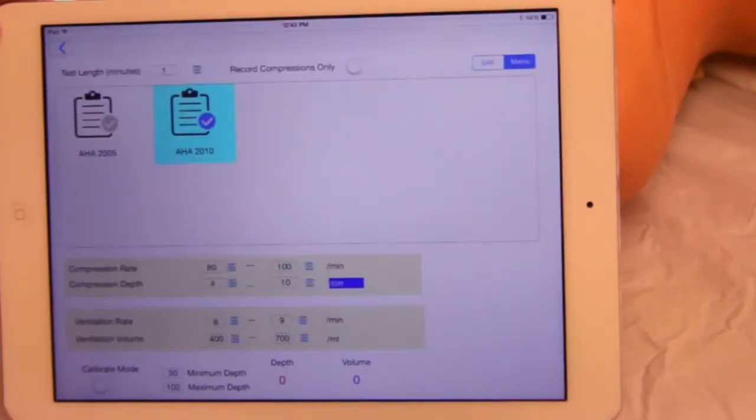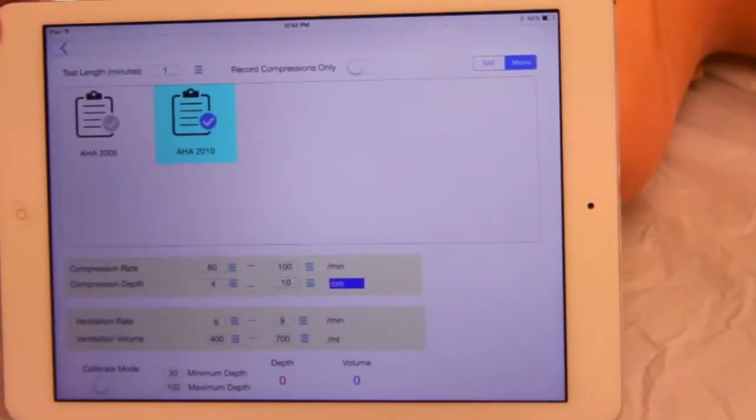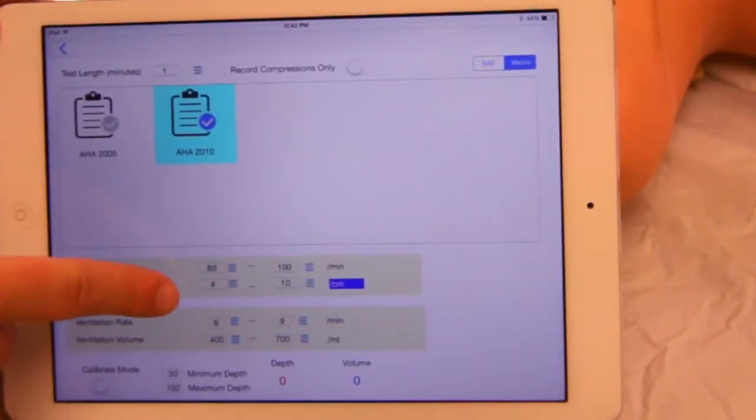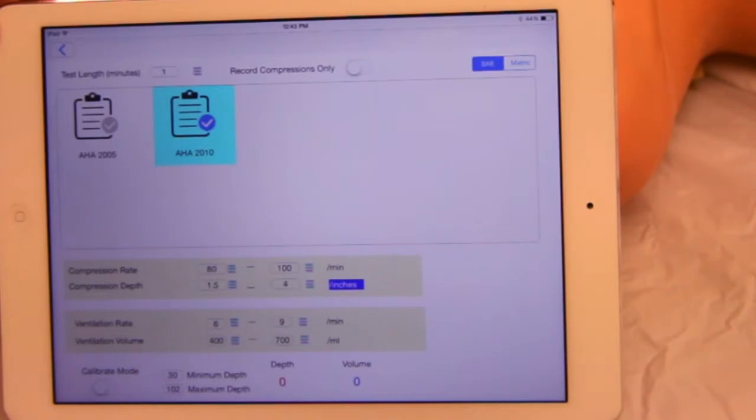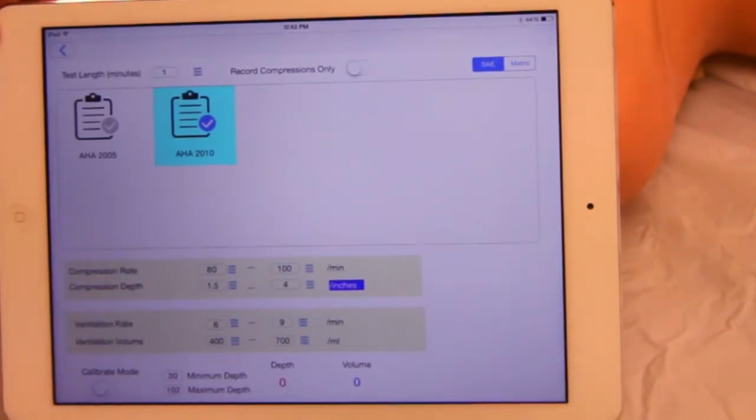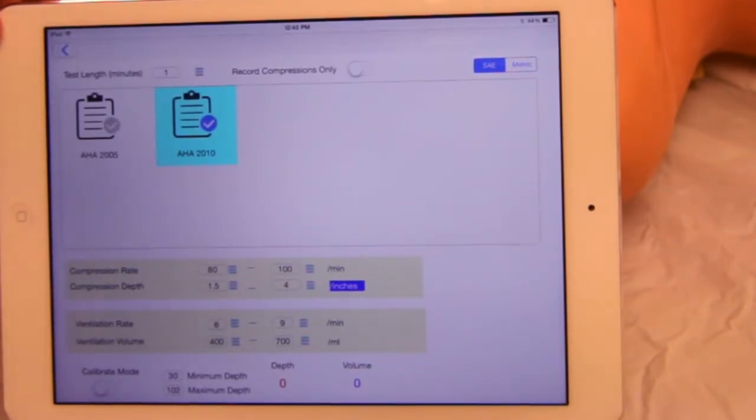You can use metric or SAE measurements. You can also customize settings for your own training.